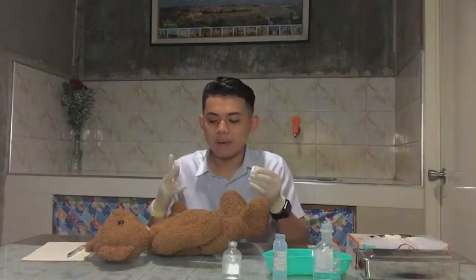Now apply clean gloves, and I have already done that. This is to prevent transmission of microorganisms, and the agency protocol is to clean the site with an antiseptic swab. Start at the center and clean in a widening circle about 5 centimeters. This is to allow the area to dry thoroughly, and place and hold the swab between the third and fourth fingers of your non-dominant hand after.